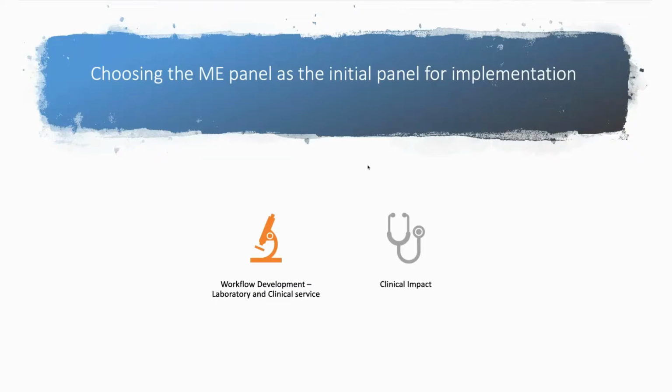As Arpad and the group were setting up everything, we had conversations as to what should be our initial panel. One of the things we talked about was the meningitis encephalitis panel, because we really wanted to look at what the clinical impact was going to be. As Arpad mentioned, the emergency department is doing lumbar punctures on patients.